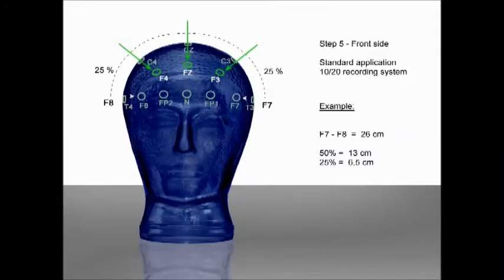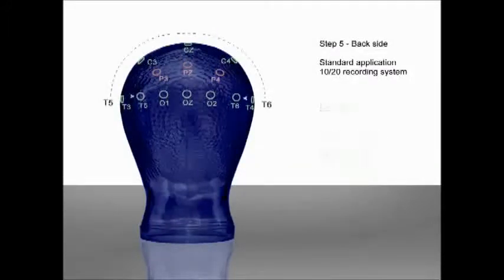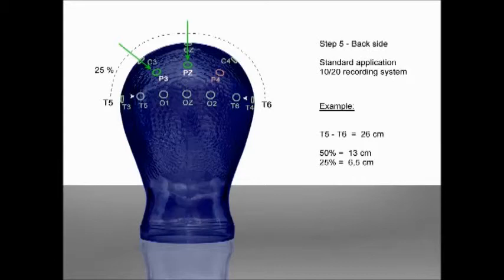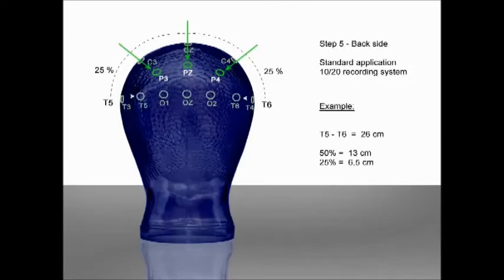For the final line, place the measuring tape at point T5 and run it over the intermediate mark Pz to point T6. Make the final mark for Pz at the halfway point of the measured distance. Mark P3 at one quarter of the distance from T5, and mark P4 at one quarter from T6. In our example the distance is 26 cm, giving Pz at 13 cm, P3 at 6.5 cm from T5, and P4 at 6.5 cm from T6. This means all marks for the forward and back half of the head have been made. Now we will show you the correct placement of the cap and the connection.